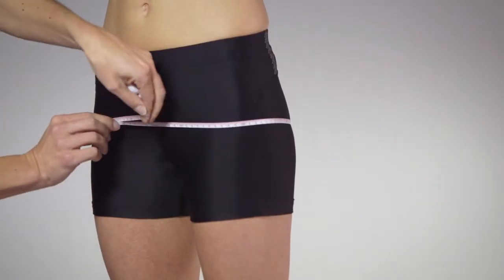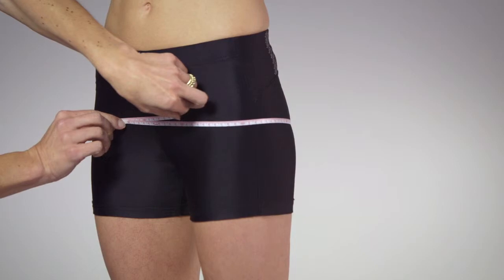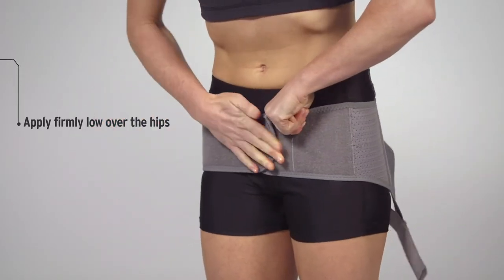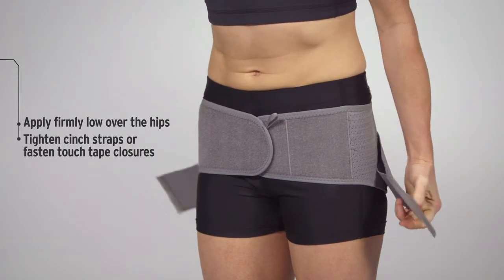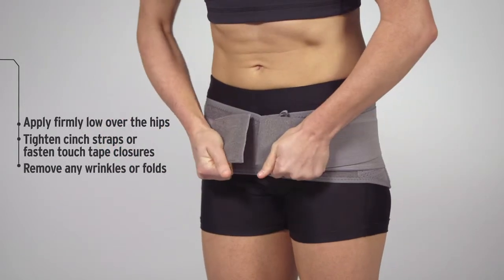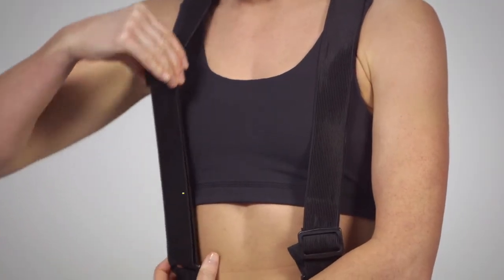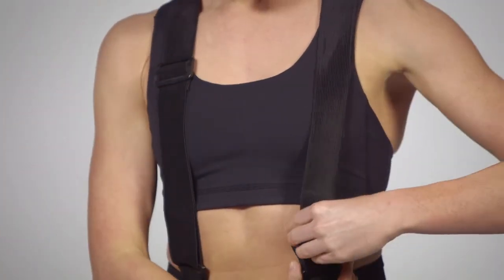To fit the Opal back supports, determine the appropriate size by measuring the circumference of the patient's lower hips. Once the correctly sized support is chosen, apply firmly low over the hips. Tighten cinch straps or fasten touch tape closures as necessary and remove any wrinkles or folds. Shoulder straps will require adjustment for the industrial lifting belt.